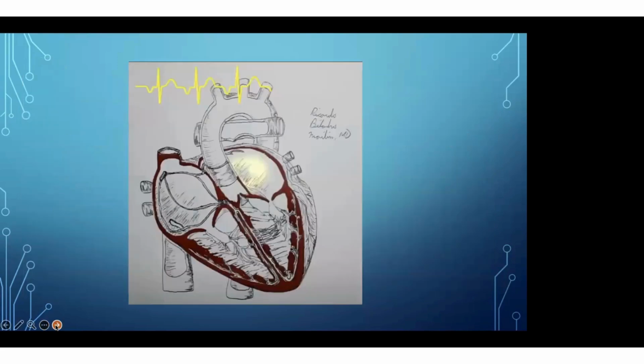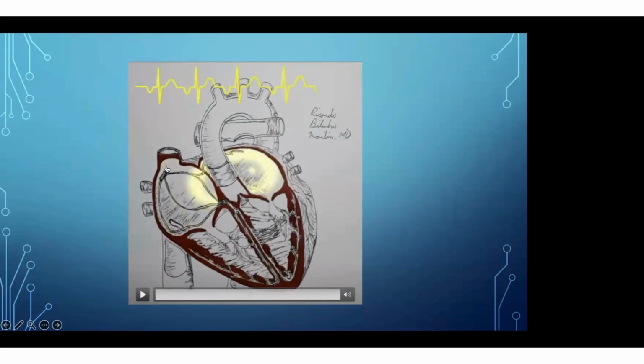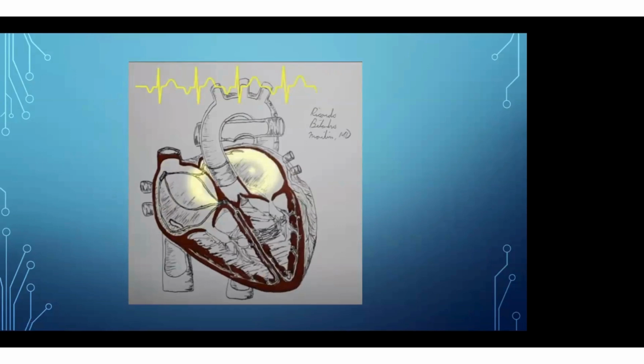This is paroxysmal tachycardia, you all know. This is the pictorial diagram. Usually the SA node is firing, but here you can see the left atrium has started firing, and it is activating the ventricle. So this is ectopic atrial tachycardia. This tachycardia is actually faster than the sinus nodal rate, so the sinus node is suppressed, and the LA focus takes over the heart and beats it in a faster manner, 120, 130 like that. Even in sleep it will be like that. So the patient will develop reversible LV dysfunction later. So identify this arrhythmia and treat it, and you will conserve the LV function.